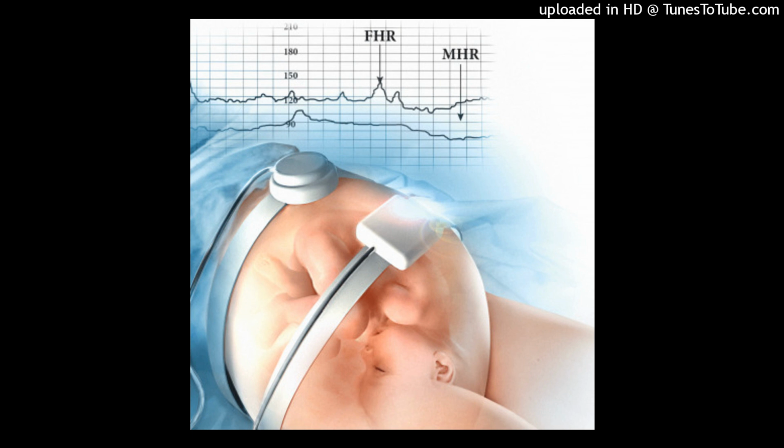When a tracing warrants better assessment of frequency, duration, intensity, resting tone, and relaxation time, an IUPC may be inserted into the uterus transcervically. This sterile, flexible catheter measures actual intrauterine pressure, figure 14.7. Presently, there are 3 IUPC types: fluid-filled, transducer-tipped, and air-coupled sensor-tipped. Data are transmitted by an electrical signal that converts uterine pressure data into millimeters of mercury, mmHg. This pressure is then displayed on the fetal monitor.